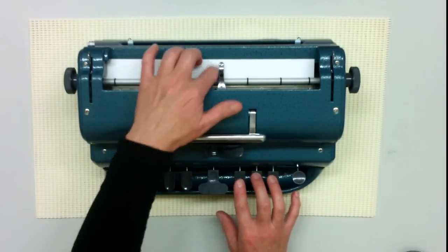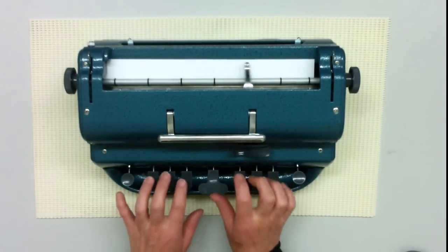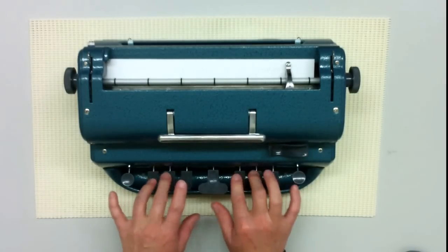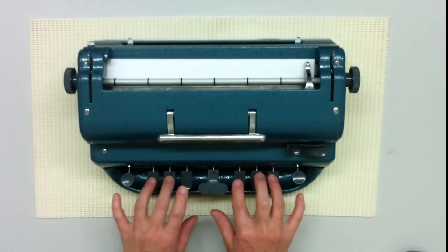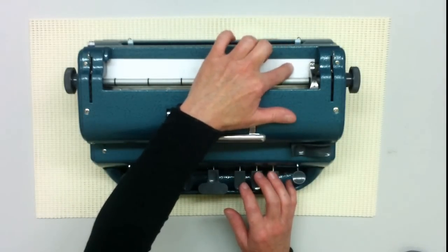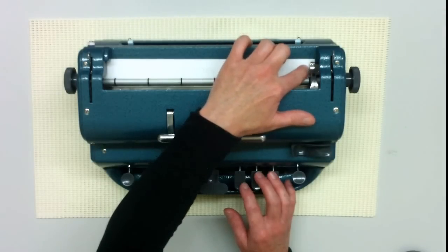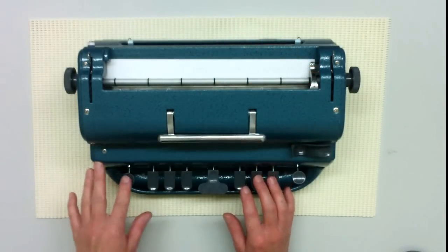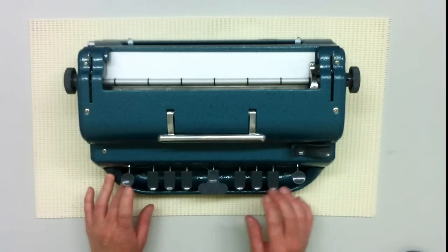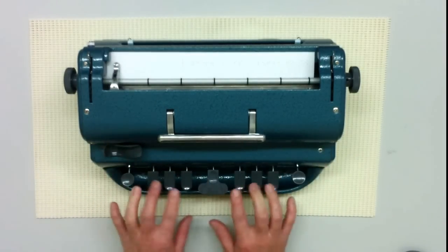I'm just going to write a sentence to show you how we do it. And what I've done, I heard the bell, which meant that I knew that I only had a few cells left on the end of my line, finished the line, and now I'm going to press the new line button and push the cursor all the way to the left and continue my sentence.